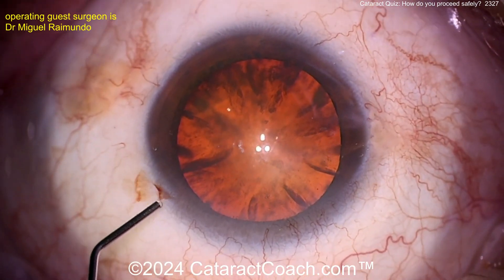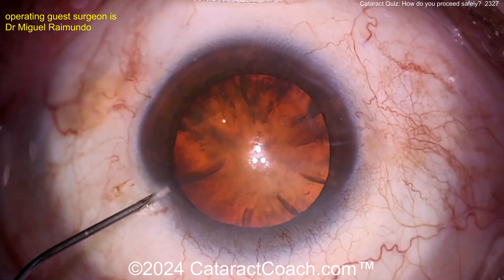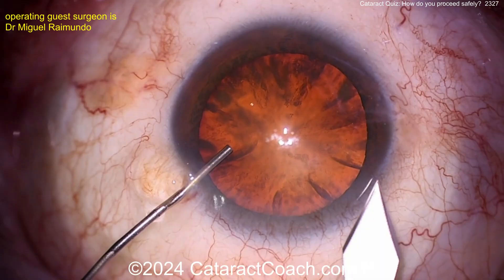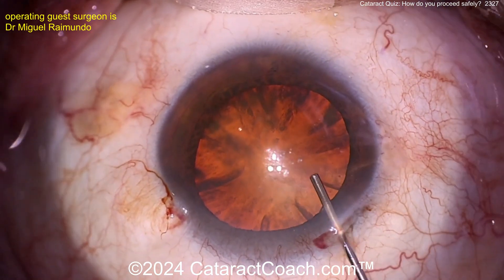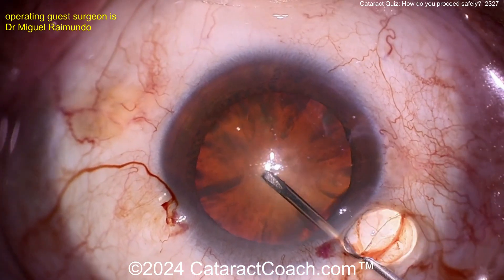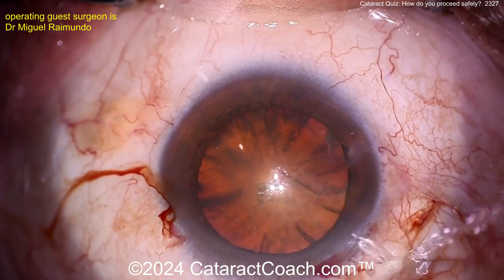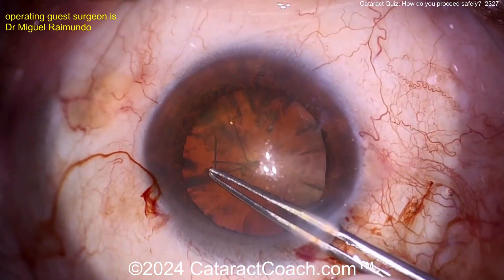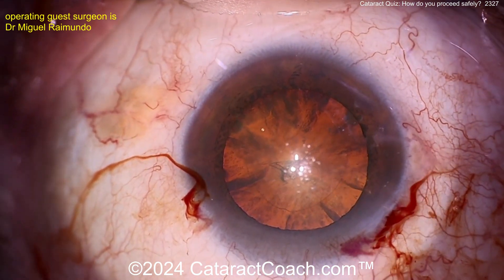We've featured this topic before on CataractCoach — go to cataractcoach.com to review it. Now here comes the viscoelastic going inside the eye. Let's get the main incision made, using the cannula to hold the eye. There's a good limbal incision. Now the capsulorhexis — a 5mm centered round capsulorhexis is so important. You may be putting in a sulcus IOL because the posterior capsule has already been penetrated by that injection. Take your time, make it pretty.